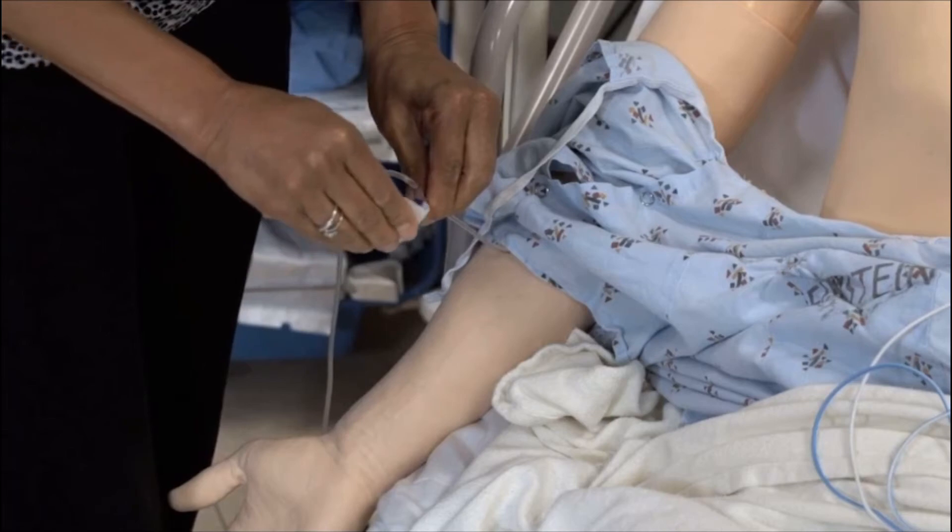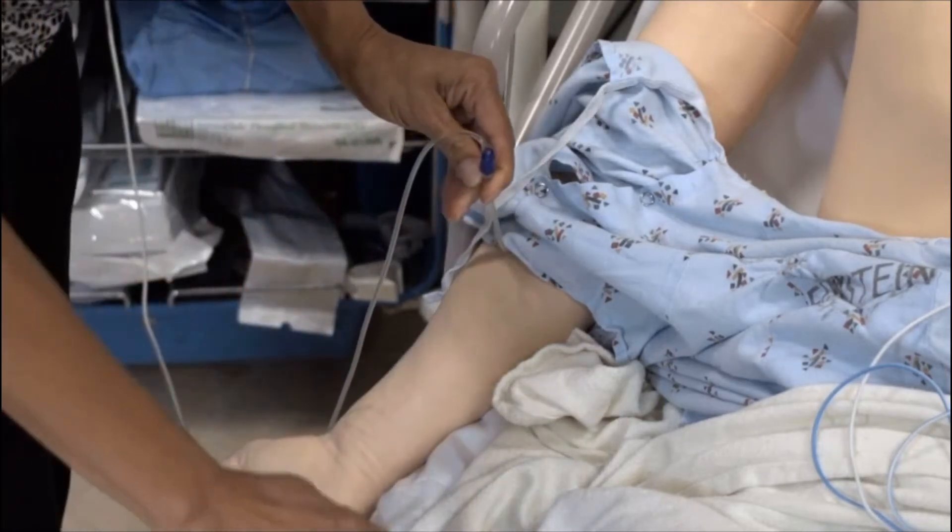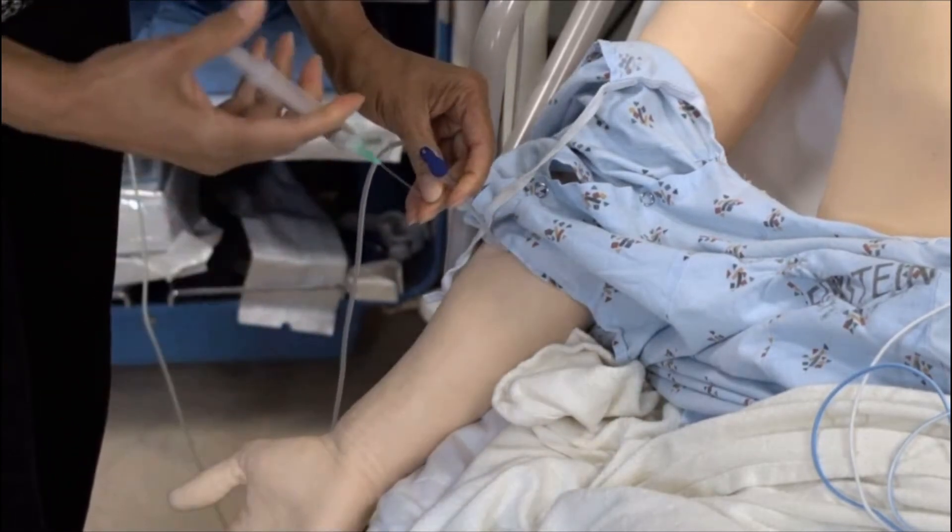Because the procedure is frightening and painful, give IV analgesia and sedation if time and patient condition permit.